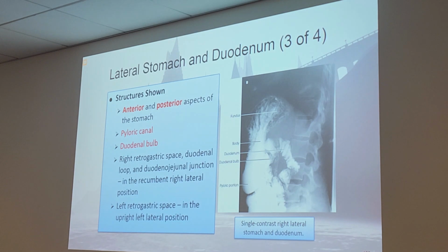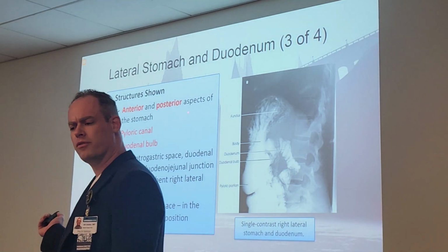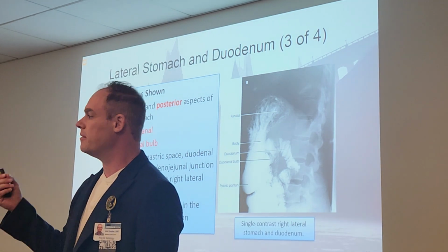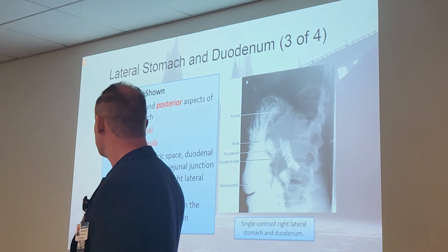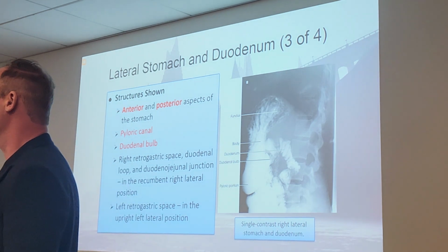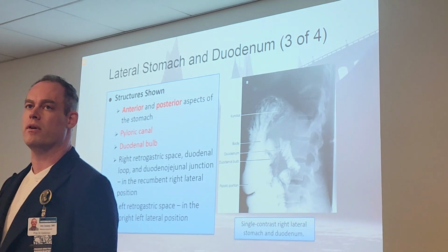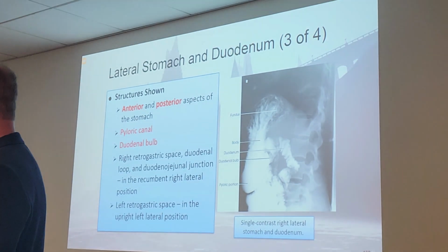What is this picture? This is a lateral. Okay, it just threw me off because I think I saw the duodenal bulb on the right. Just to review again, a lateral is going to share the same barium and air distribution as a PA. For laterals, we're talking about a regular lateral, not decubitus. For a regular lateral, barium's in the body and pylorus, air is in the fundus.